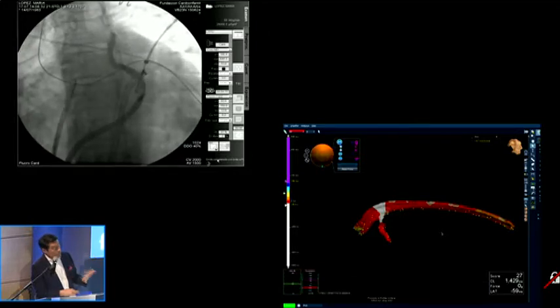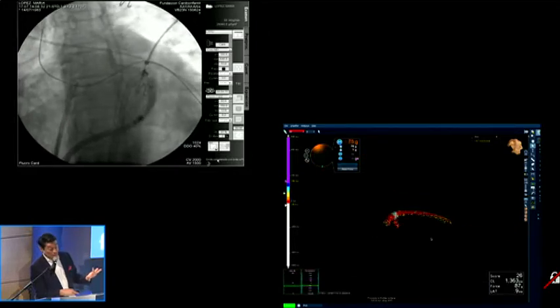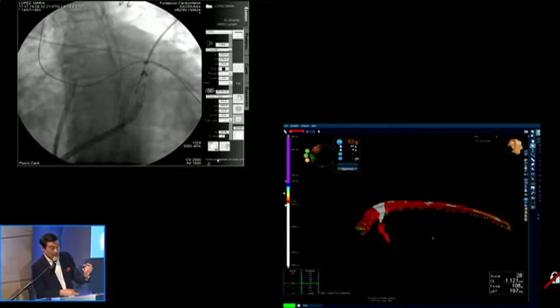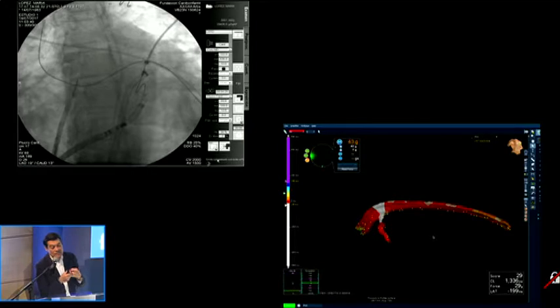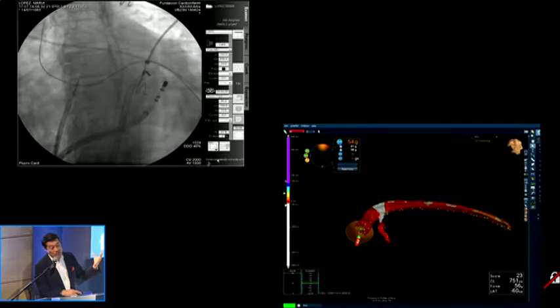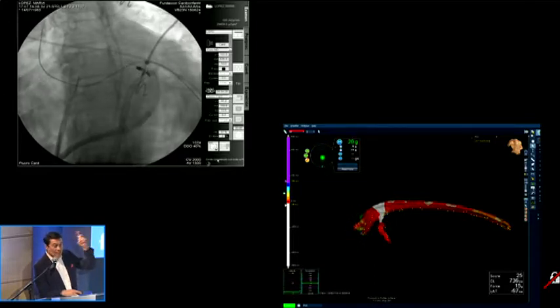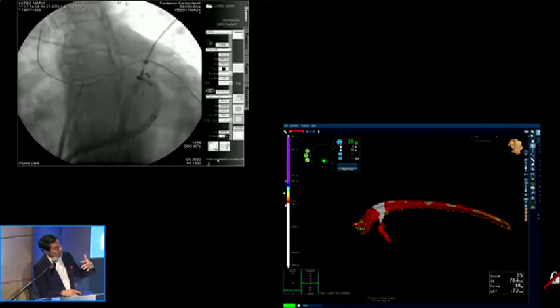area. So what we propose as an approach is a combination of multi-electrode with a guide wire in order to reach the more specific site under guidance and concentrate there with longer 3-5 minute applications, but not filling the entire segment, the basal segment, with these kinds of applications, because this is what increases the risk of complication. It is not infrequent to have steam pops forming there, and we don't know if that is what favors cardioembolism.